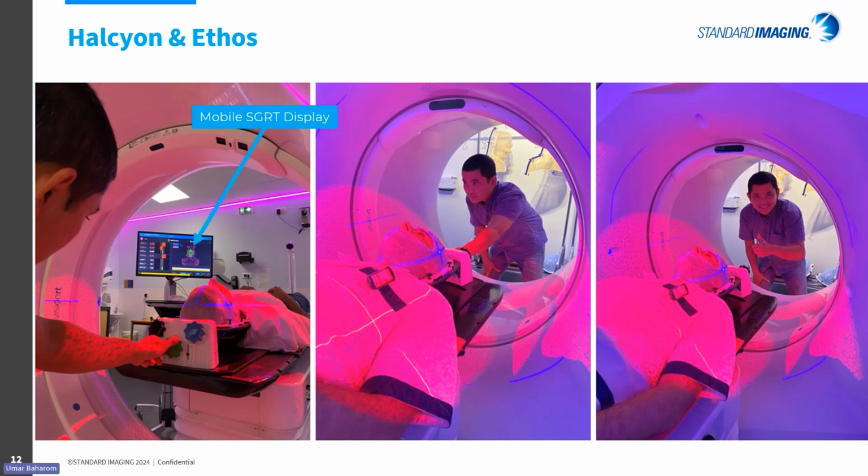The adjustment knobs can be accessed from either behind the board or from the side of the patient in front of the board. The image above shows the user making the adjustments while looking at the mobile SGRT display. Each knob is color-coded and clearly labeled. The user will turn the corresponding adjustment knobs until the deltas for the pitch, roll, and yaw are zeroed out. The device is designed such that all adjustments are very smooth and continuous, so you can achieve a resolution of less than 0.1 degrees.